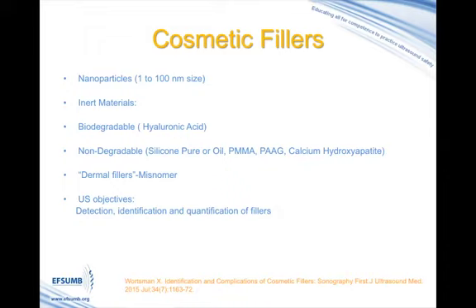These are nanoparticles that can measure 1 to 100 nanometers in size. They're supposed to be inert materials and they can be classified in biodegradable, such as for example hyaluronic acid, and non-degradable deposits, which are synthetic materials, such as for example silicone, which can be pure silicone or silicone oil, polymethylmethacrylate, polyacrylamide, or calcium hydroxyapatite.